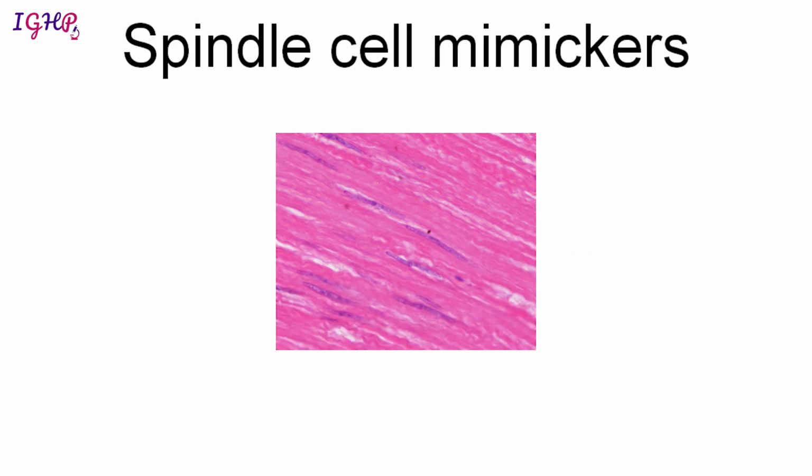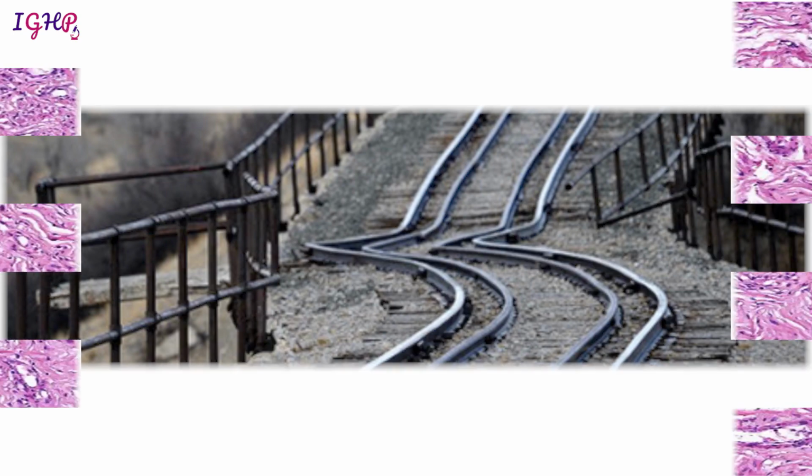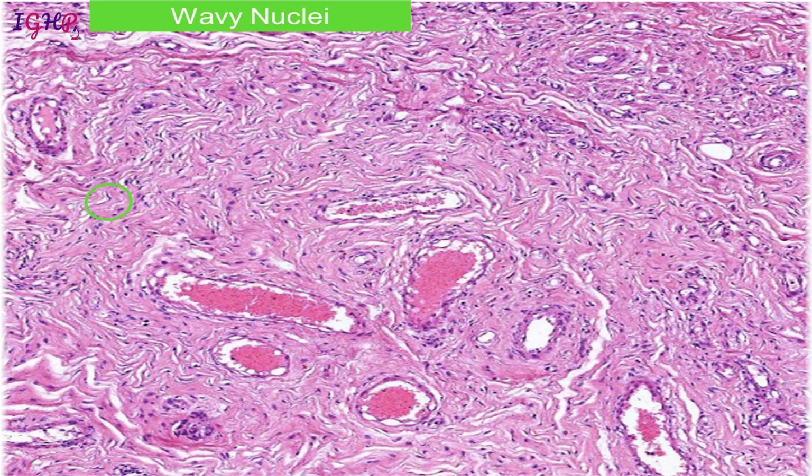Like I said, this is a cell. This is definitely a spindle cell, as we all can say. In this cell, we could see that it has got elongated nuclei, and the nuclei are blunt at one end. So they are not pointed, and they are showing blunt ending, and their cytoplasm is indistinct and intensely eosinophilic. There is a distinct type of spindle cell which is not as straight as we have seen in the previous one, but it shows some bend, or some buckling, and that kind of spindle cells are the neural cells.